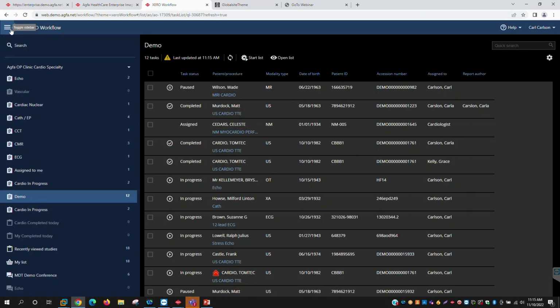So keep in mind that our solution for enterprise imaging is a complete CVIS solution. So not only do we offer reporting and post-processing image analysis for all the procedures that you're doing within your department. So I hope you've enjoyed this video today, and we look forward to working and talking with you in the future.